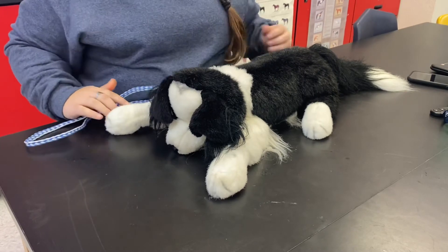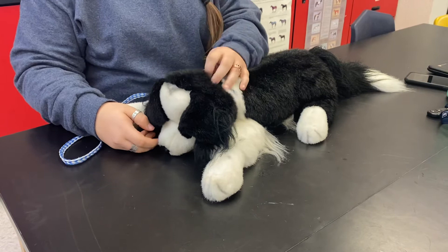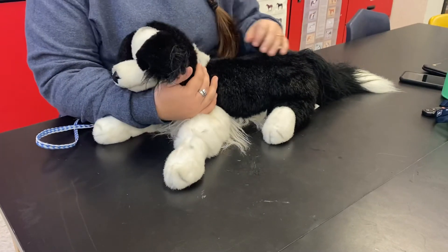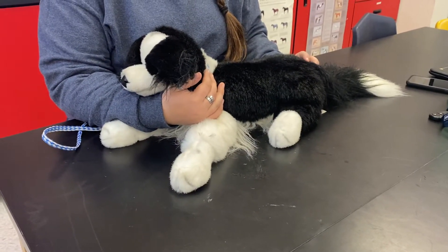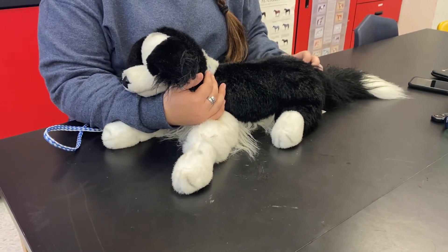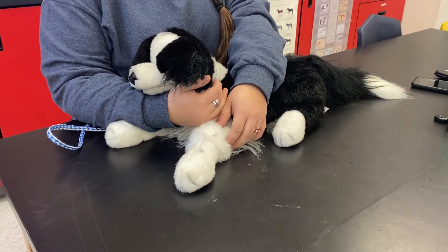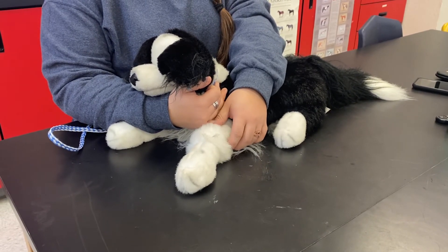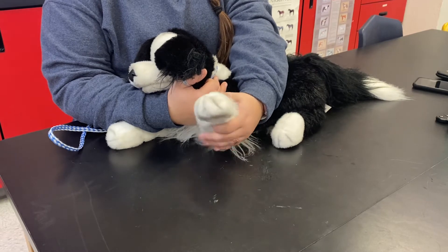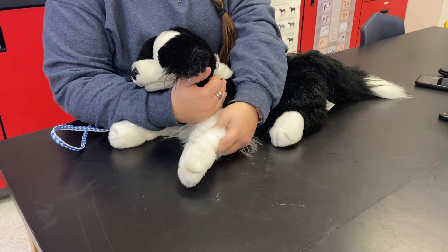The student will then restrain the dog for a cephalic vein draw. The student stands on the dog's right side, wrapping his or her arm around the dog's neck. The student holds the dog's left forelimb with the elbow and palm of his or her hand and extends the limb forward toward the person performing the procedure.